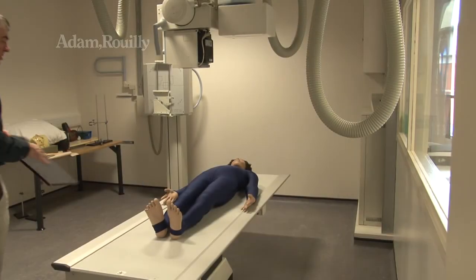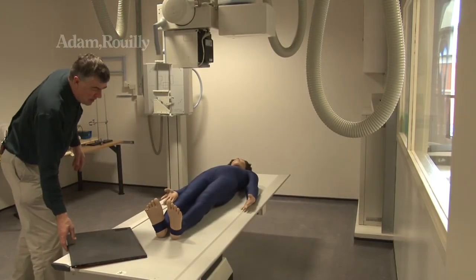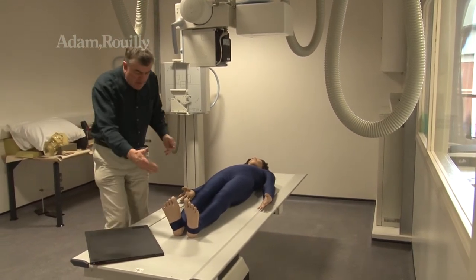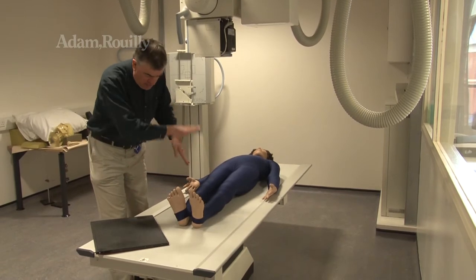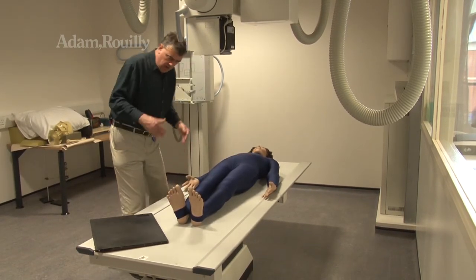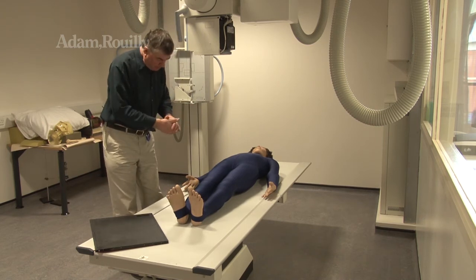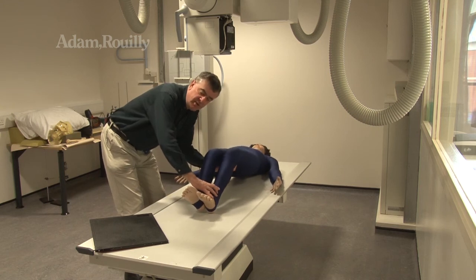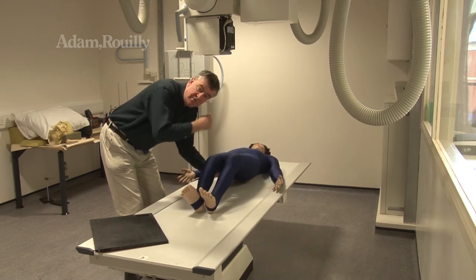So the penultimate image is going through the processor. We're now going to do the last image. This one's a little bit more of a challenge. I want to get the feet from sort of looking from the top. So I don't want to put the X-ray tube here. I haven't got the bodies in the way. So I'm going to flex the legs and put some pillows there so that we have them in this sort of position, and I can then take an image from this direction.